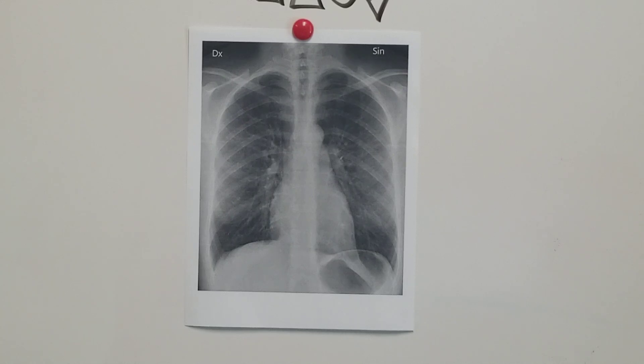Next will be C, which is cardiac. You want to look at your cardiac silhouette. Make sure it's not super enlarged, like in a cardiac or congestive heart failure patient, where it's over half the width of the patient's chest cavity. Make sure there's no pneumopericardium or striping of the pericardium.